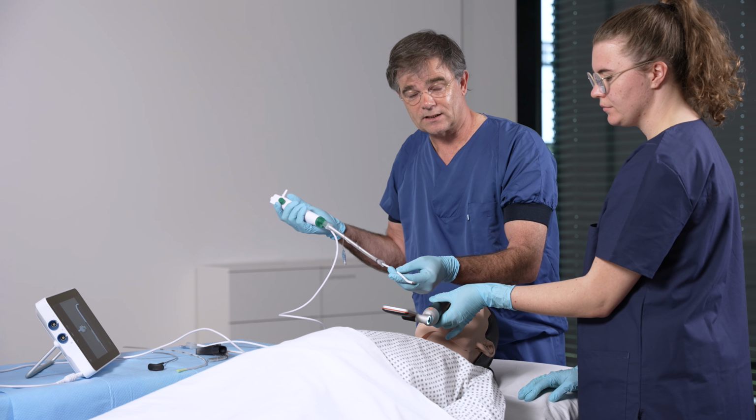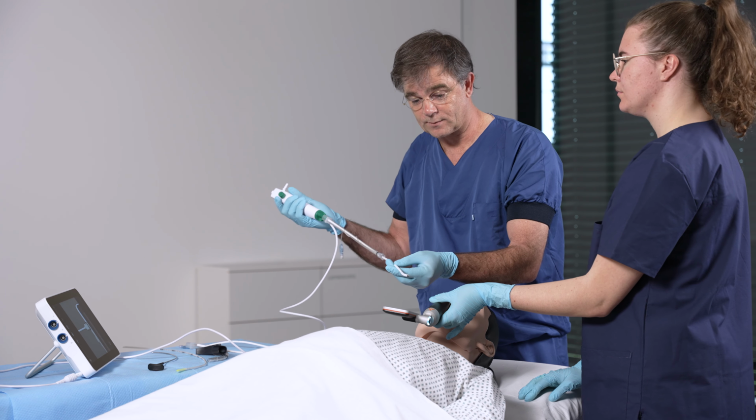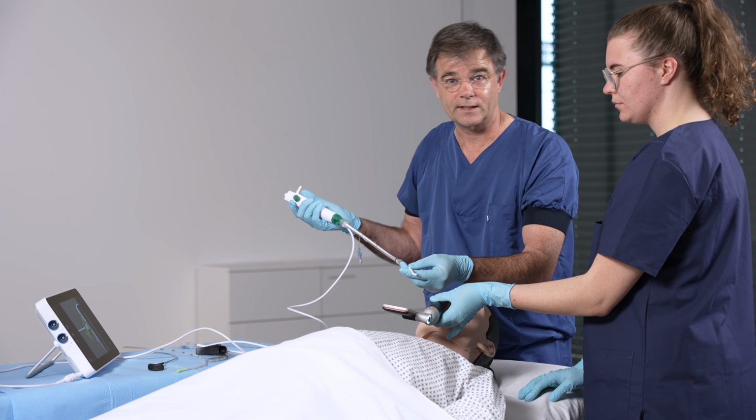So the VAFI technique is used a lot of the time. You need a flexible scope and a video laryngoscope and a very good assistant.